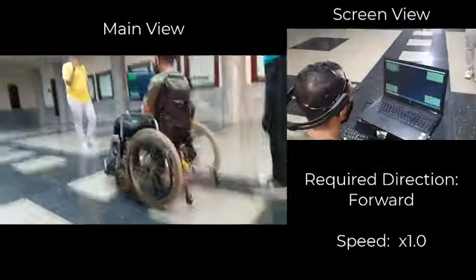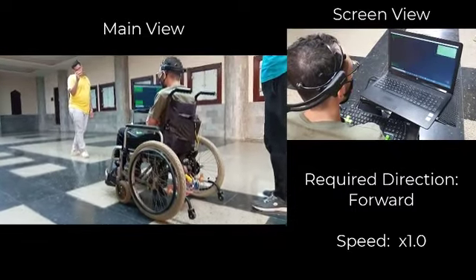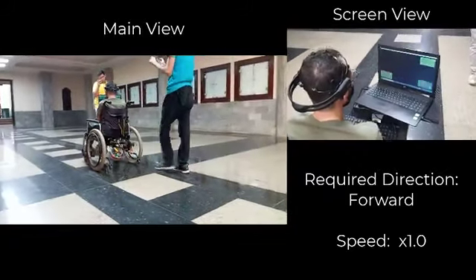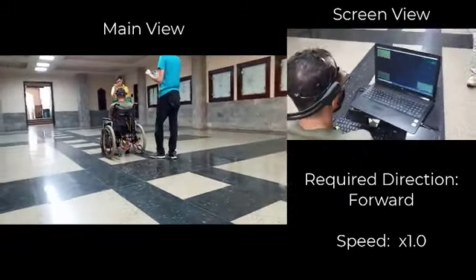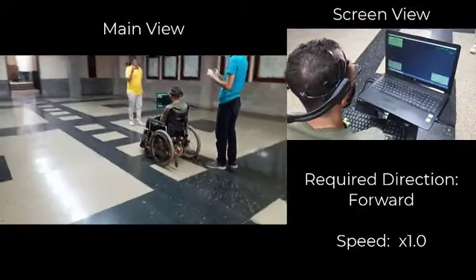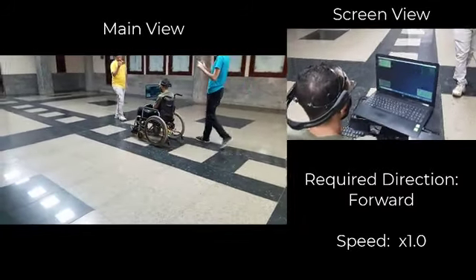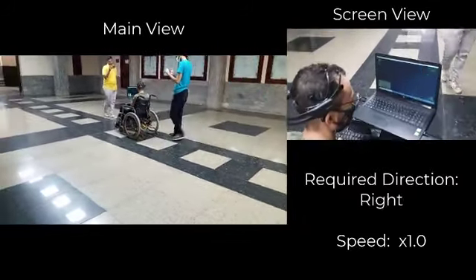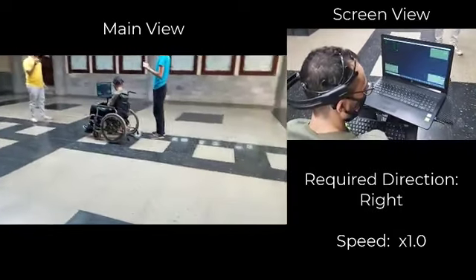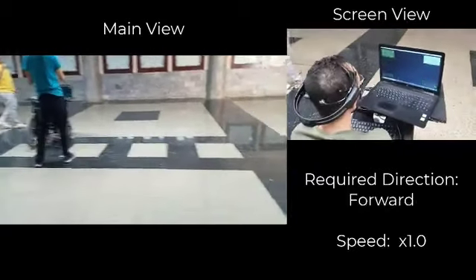You can see the user looking at the required instruction in the screen view on the right. You can also see the instructions written below for clarity. As you can see, the wheelchair executes the forward instruction correctly. The user now wants to move to the right, which is also executed correctly.